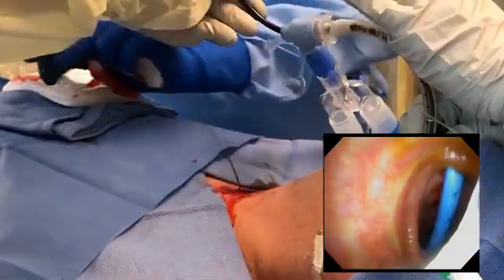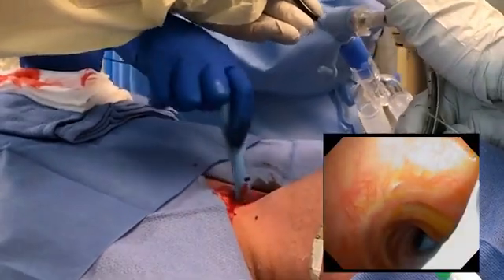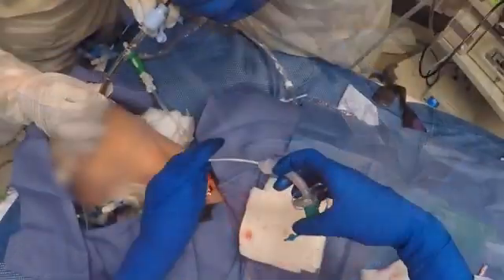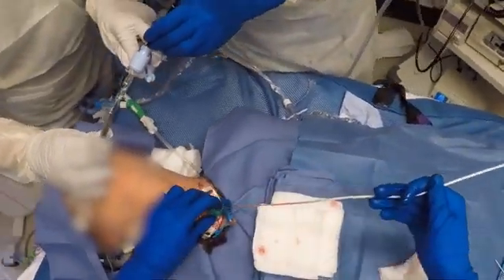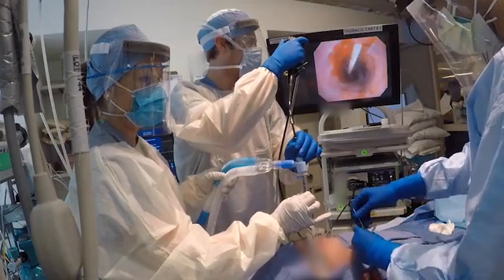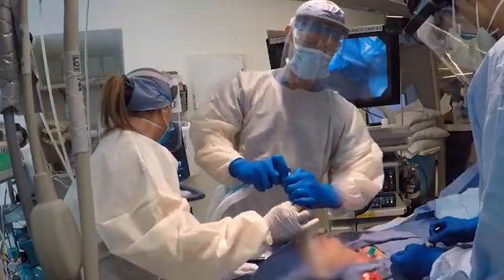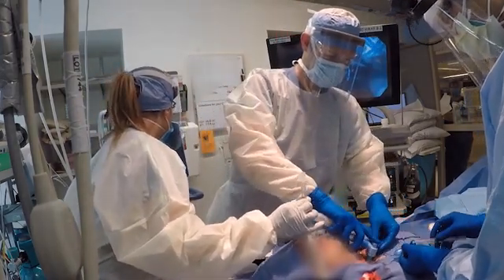Advance the small tracheal dilator over the wire to dilate the tract. Remove the small tracheal dilator and advance the single-stage progressive dilator over the wire with the protective sheath loaded. Remove the progressive dilator, keeping the wire and protective sheath in place. Then insert an appropriately sized tracheostomy tube directly into the trachea over the wire and protective sheath. If using a flexible tracheostomy tube, insert the tube with the curve directed toward the patient's head. Once you visualize the tube in the patient's trachea, rotate the tube 180 degrees to its normal orientation. This prevents the tube from creating a pre-tracheal plane.